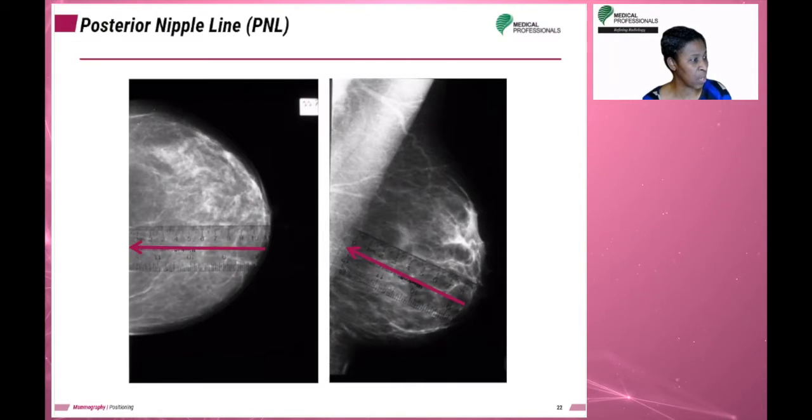Some facilities do a screening mammogram post-mastectomy. What's the suggested practice? That is correct. Some facilities do require you to image a post-mastectomy patient. I've done that in the past. Typically, most often, what I can get is a limited MLO, yes, but an MLO.